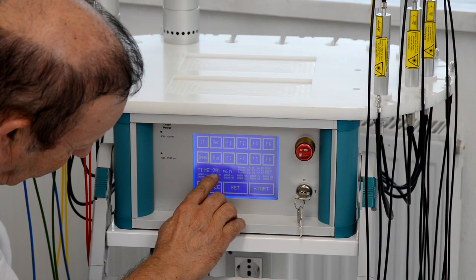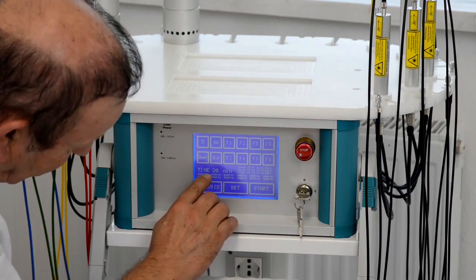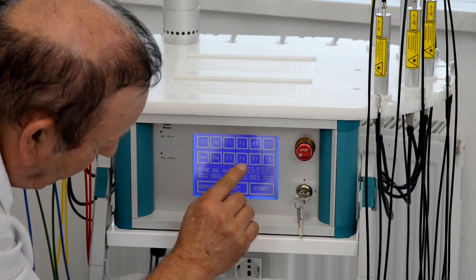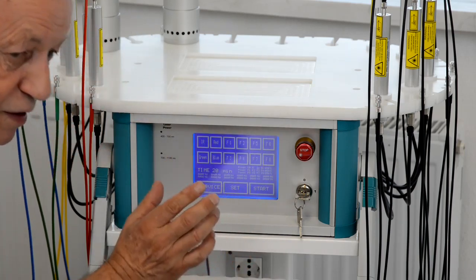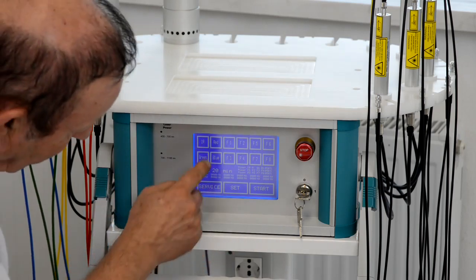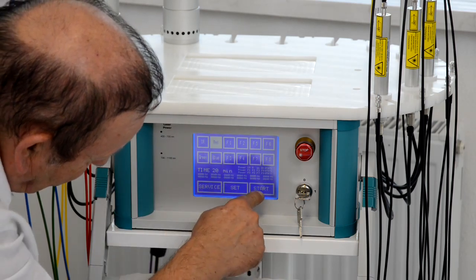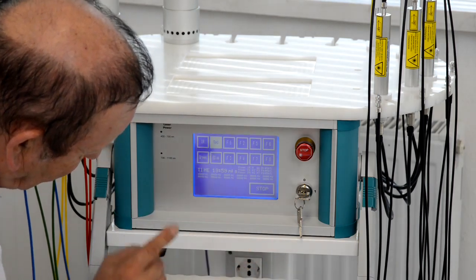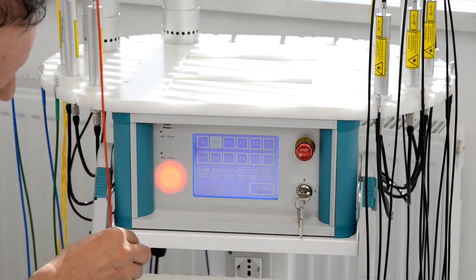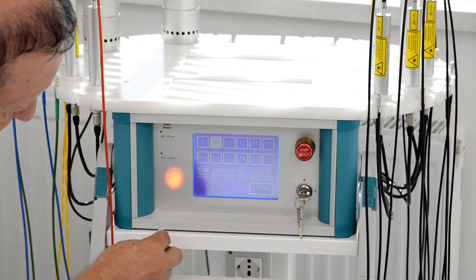That means we have already preset a running time, a treatment time of 20 minutes. And if I switch the lasers on, they all will run on 50% power. So I show you an example. I switch the red laser on, I press start, and now it will work for 20 minutes with 50% power. And here you can see the red laser beam.